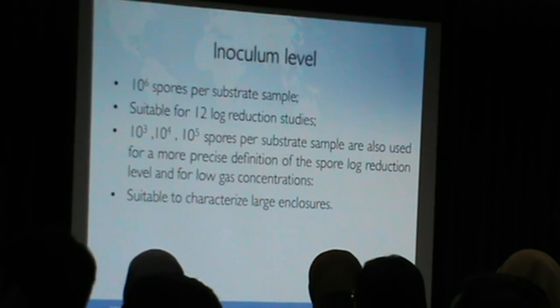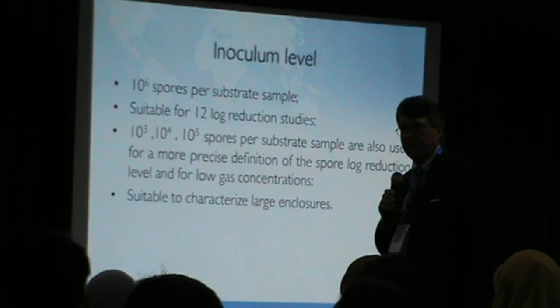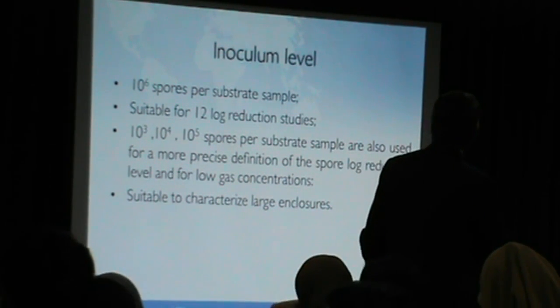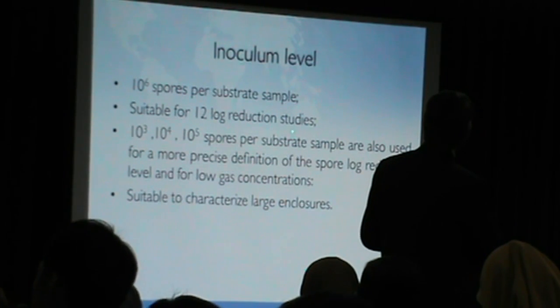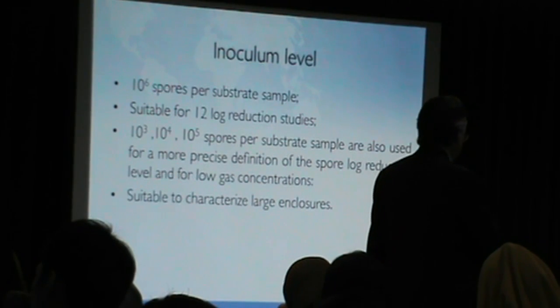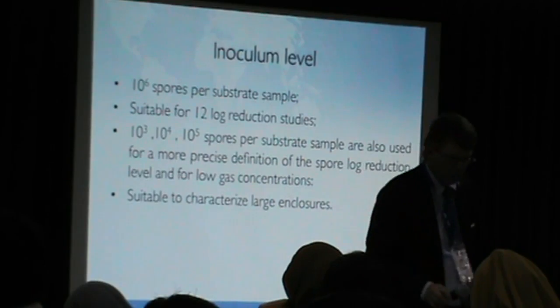So how many spores do we have to apply? At least 10 to the power of 6, 1 million, suitable for 12 log reduction studies. There are some BIs, multiple BIs.